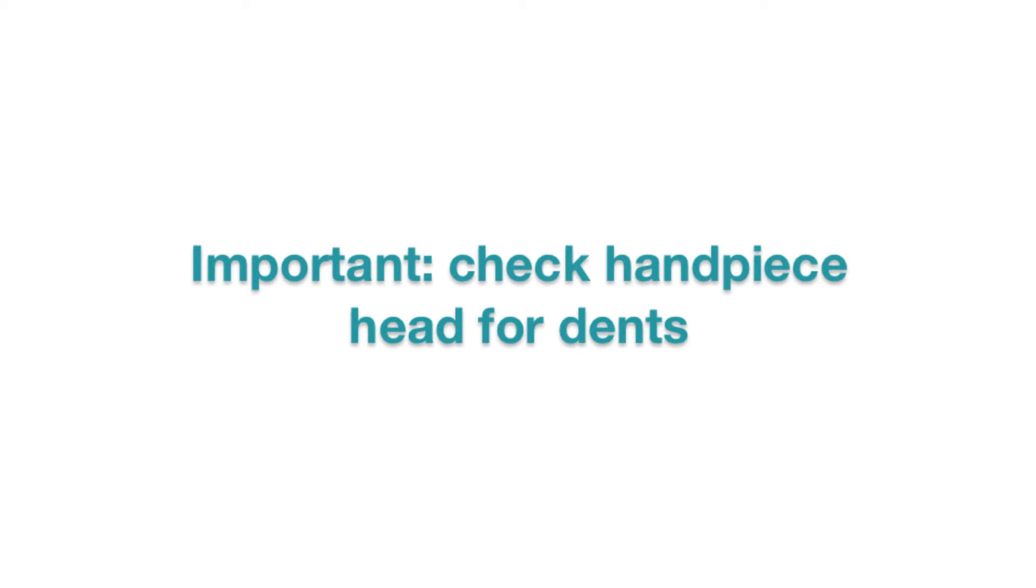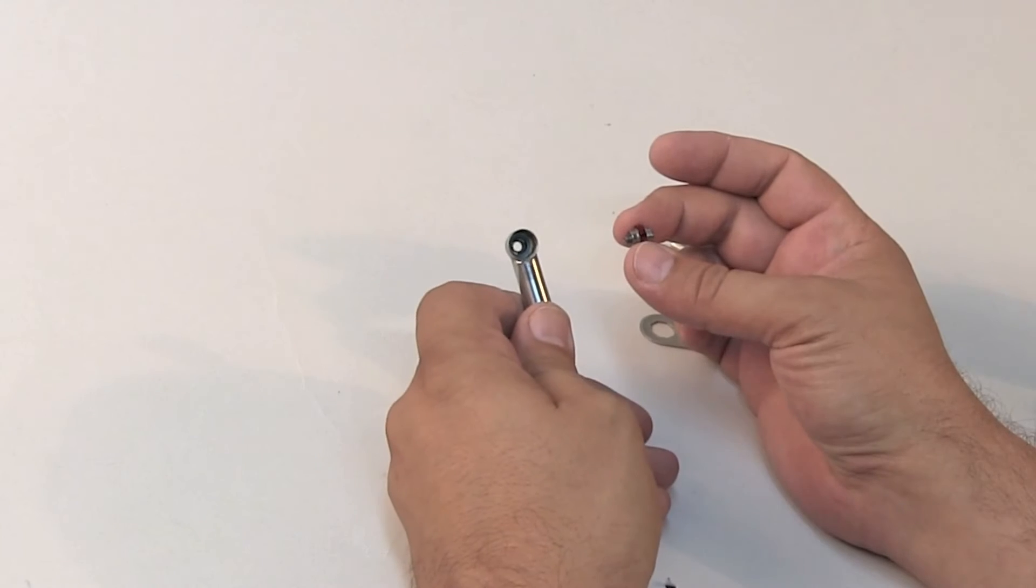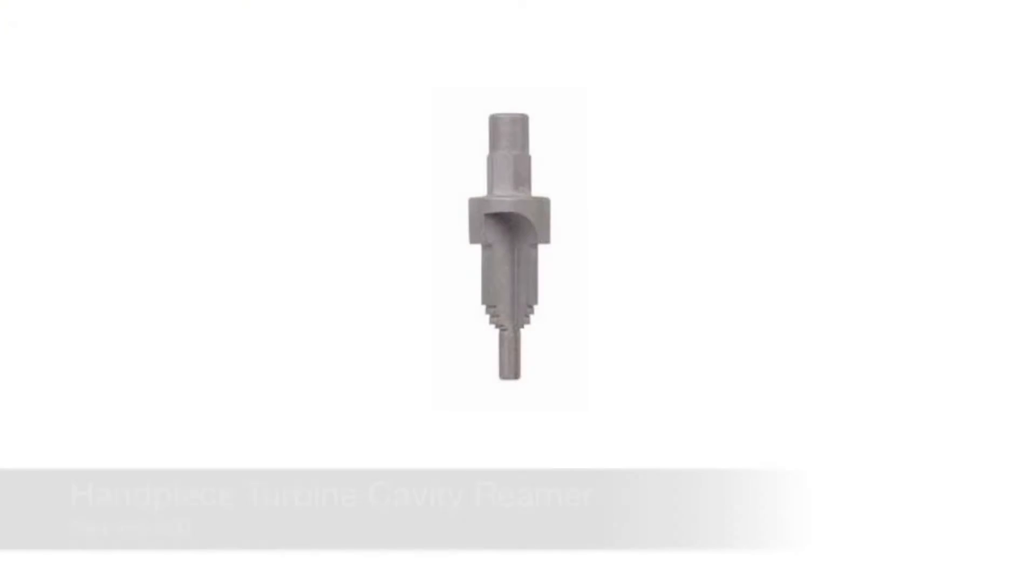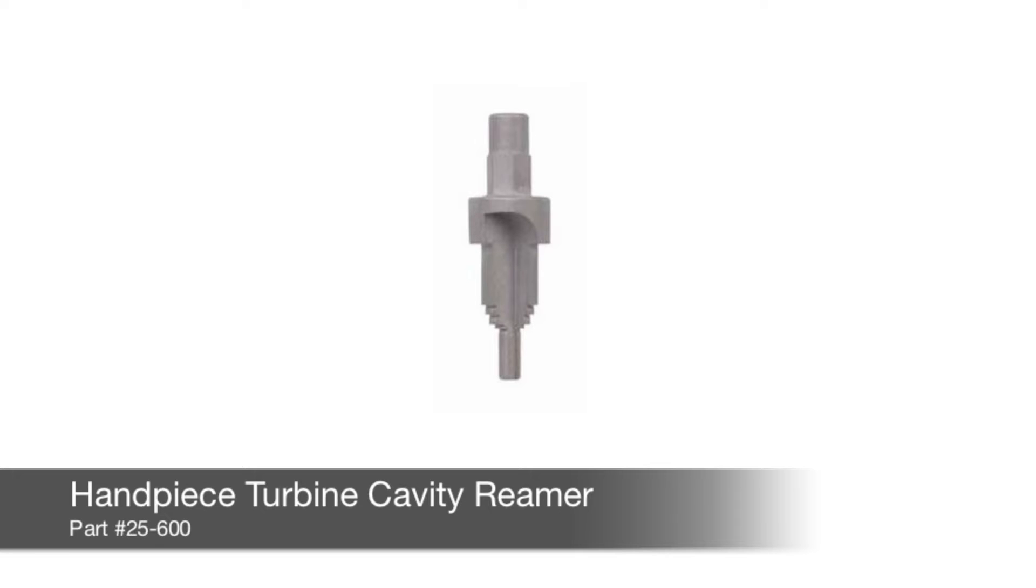Before installing the turbine, be sure to check the handpiece head for dents. If any evidence of dents, send the handpiece to American Dental for repair, or you can repair the handpiece yourself using our handpiece turbine cavity reamer.